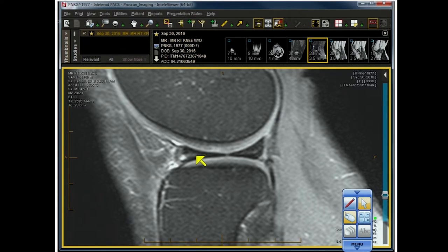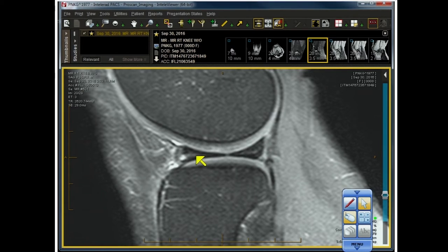You already know you have a dysplastic meniscus, and if you're a little educated you know that the meniscus splits right in the middle into two parts. So with a little bit of knowledge — which can sometimes be dangerous — you know that this entire cleavage signal has to be one thing. Don't try to over-manipulate it, don't try to overthink it.